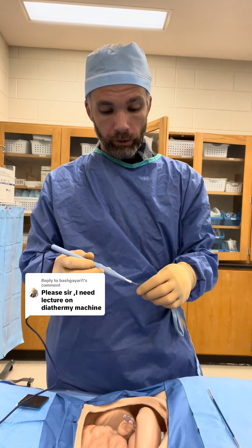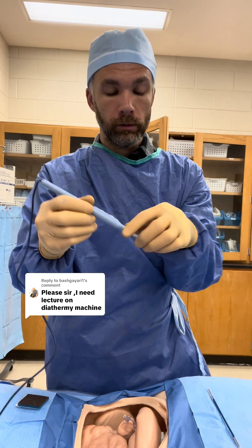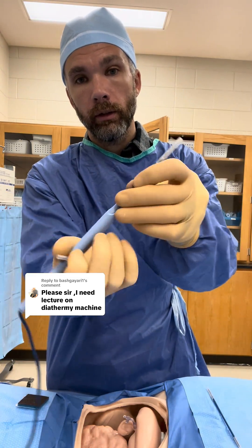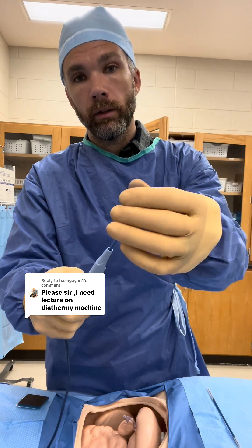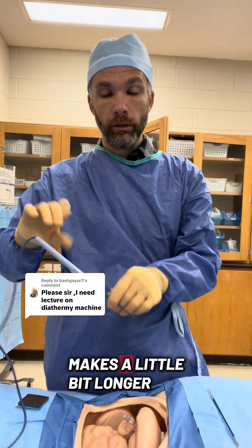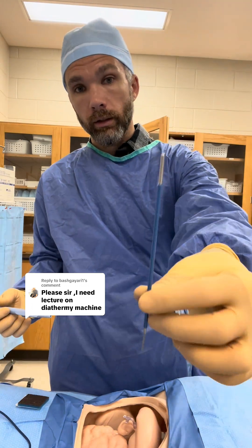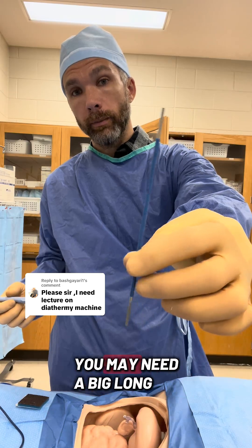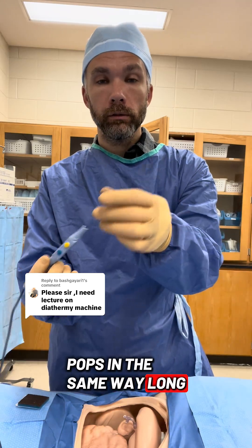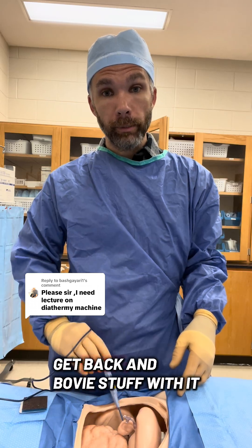You have different tips. This is the one that came on it. This is a smaller Bovie extension — it makes it a little bit longer if you're working down in a small little hole. If you're working in an open abdomen, you may need a big long Bovie tip. It pops in the same way, just long, so you can get way down in the bottom and Bovie stuff.